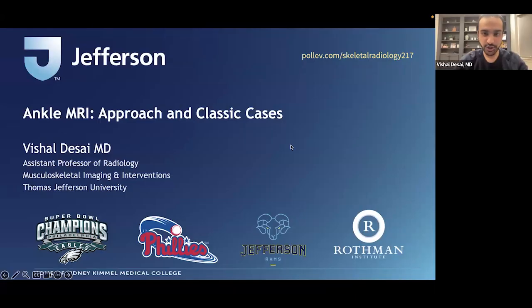Thank you for the introduction, Jenny, and good evening, everyone. I'm going to go over ankle MRI today, a bit about my approach and some classic cases. I asked our residents which joint and which set of pathology they're least comfortable with, and universally they answered ankle. So I thought this would be a good time to review some of those concepts and go over some classic cases.